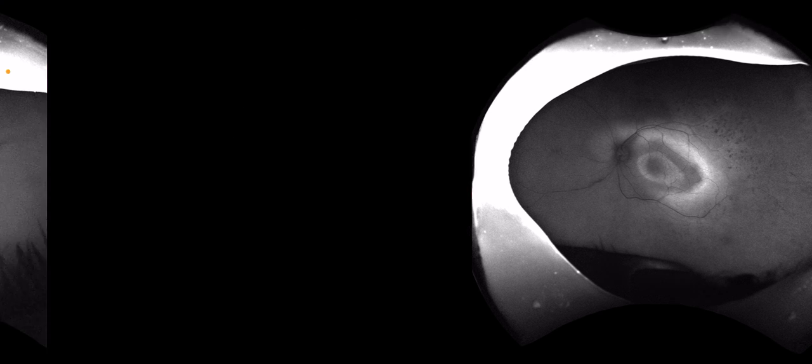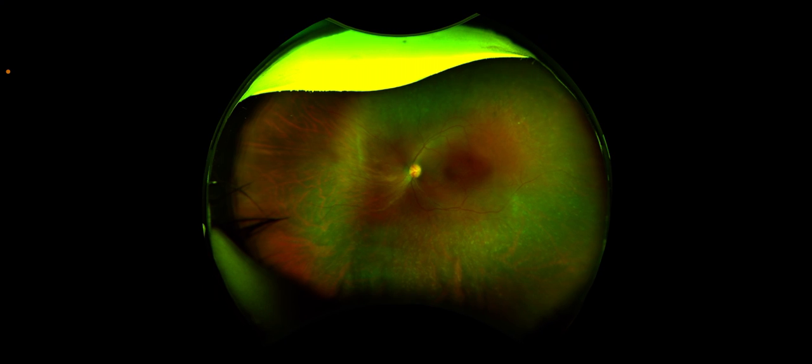This is a fundus photograph of the right eye, which discloses pigmentary changes throughout the retina as well as in the macula. This is fundus autofluorescence of the left eye, which shows hypo-autofluorescent lesions throughout the retina and a ring of hyper and hypo-autofluorescence in the macula, similar to the right eye. This is the color fundus image of the left eye.